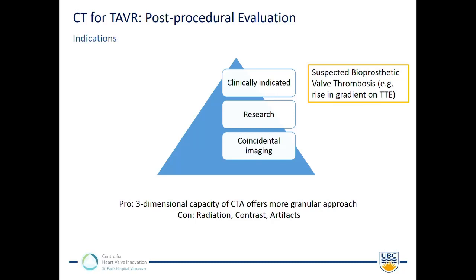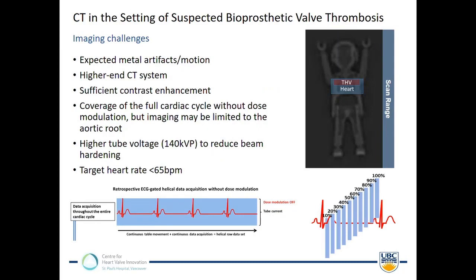And for that reason, I think you may come across patients with TAVR in situ where you may observe findings of leaflet thrombosis. CT is challenging in those scenarios because of metal and motion artifacts, and that's something which you have to keep in mind when choosing the appropriate protocol or the CT system to be used. I think what is most important is to cover the entire cardiac cycle, and that's often forgotten about. This gives you redundant data to choose from, also provides you with both systolic and diastolic information, which is important to then also judge the degree of leaflet restriction.